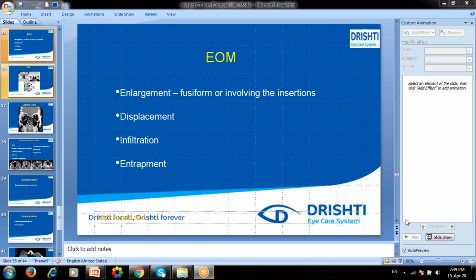Am I able to give your answer? Yes, it was pretty good, sir. There is also another question. One of the members is asking which generation of CT is best for ophthalmology. Yes, Kapil, once again: which generation of CT scan is good for ophthalmology?